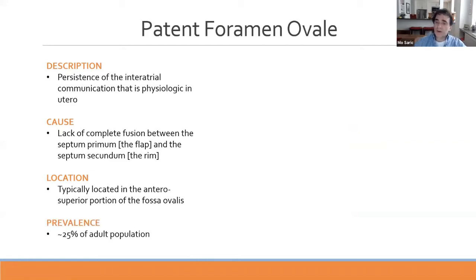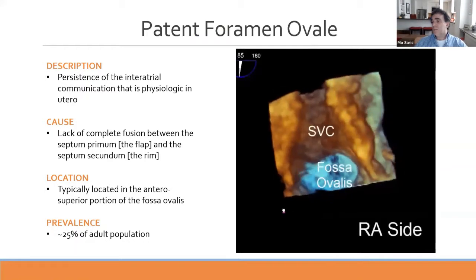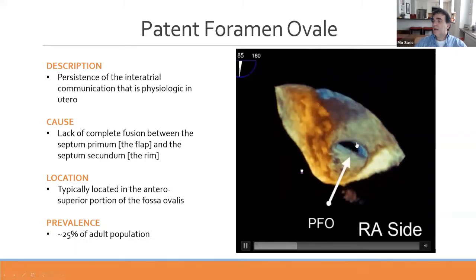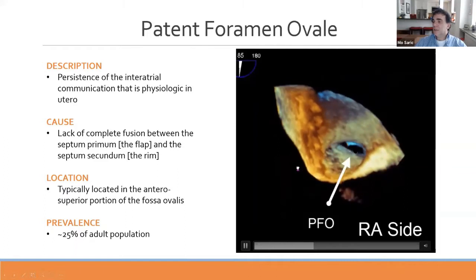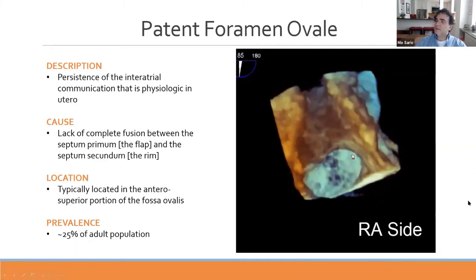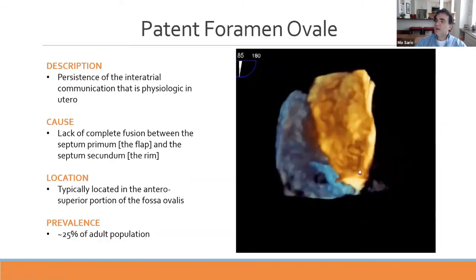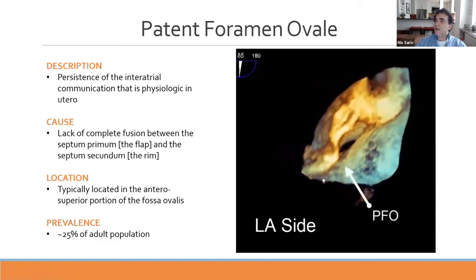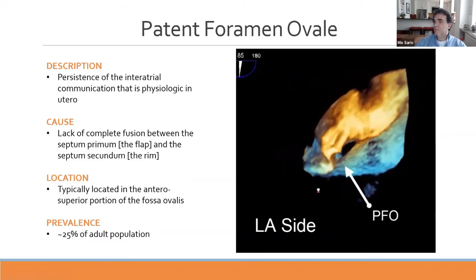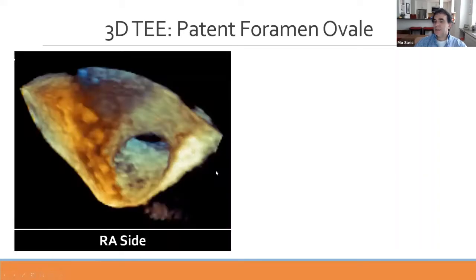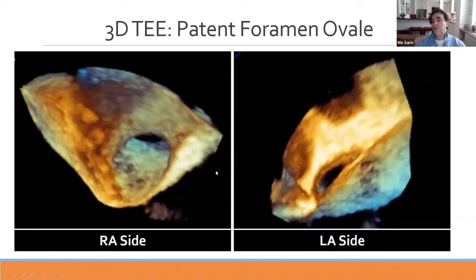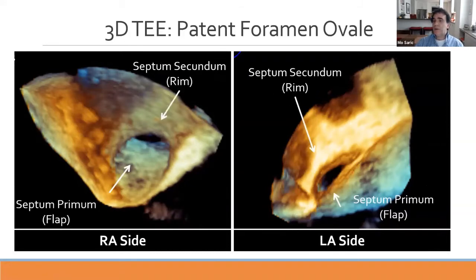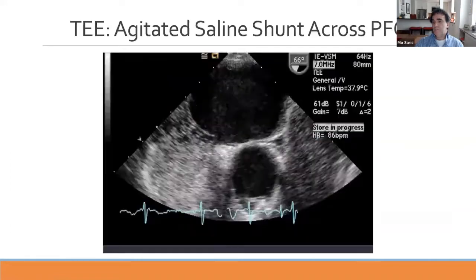This 3D moving image shows the patent foramen ovale in the supero-anterior portion from the right atrial side, and turning it around reveals the PFO from the left side—between the rim and the flap. In still images you can recognize it from both the right atrial side and the left atrial side: septum primum flap and septum secundum rim. On TEE, you can also observe the shunt directly through the PFO.